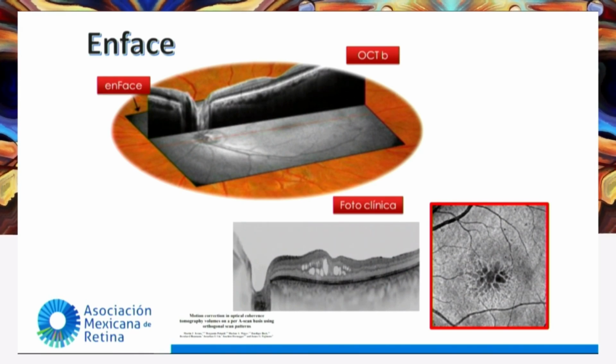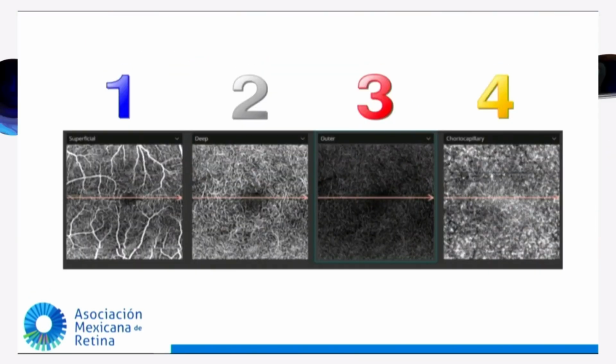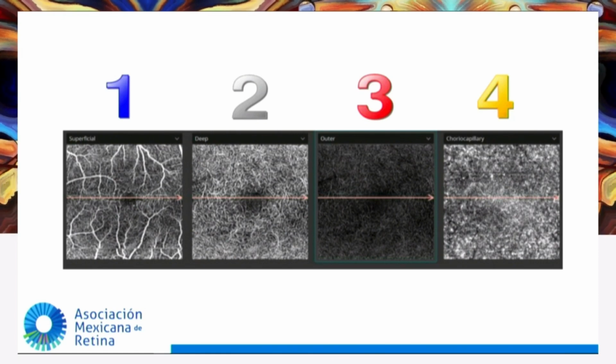Initially, people would talk about whether they've seen it ever. It is not the photo in black and white, because we now know that that en face is given by a tomographic reconstruction. It is not based on photos, but it is some sort of histological representation of the tissue rather than of blood vessels. And on en face, what matters is that we can see here cysts, and we can also see them there.